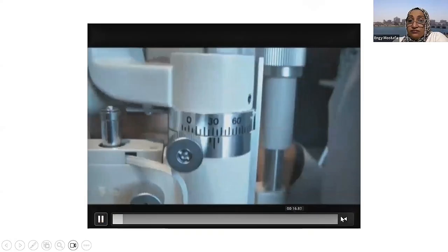And of course, in the same way with opacities, if you are going to examine the opacity and you want to have a crude idea about the depth of the opacity, you are going to use the optical section. It will give you a very good idea if it is superficial or if it's going through the stroma or even going back to the endothelium. It is a very, very reliable method, as I believe. Thank you. You're welcome.